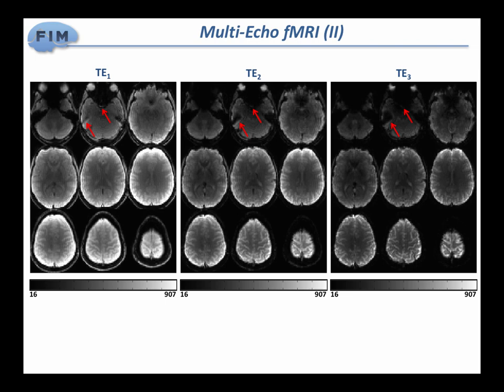There are areas where the T2 star is around 20, while there are areas at the back that might be around 40 and 50. So when we choose 30, for many reasons, we're having a compromise in which we lose signal up here. Because now we're doing another acquisition at an earlier echo, we are going to be able to recover some of the signal in these areas.